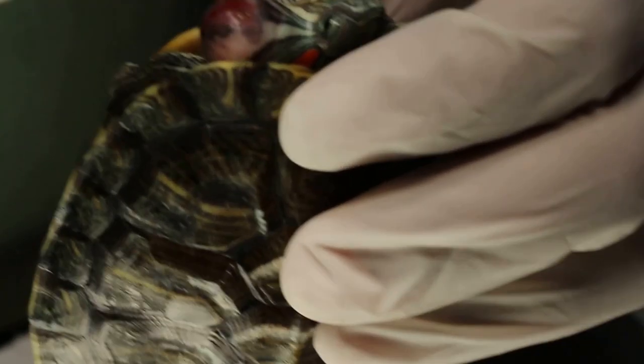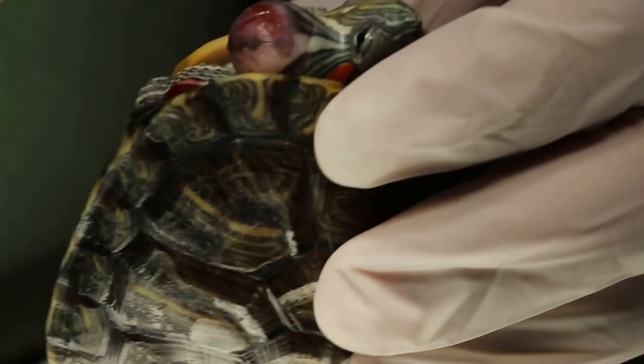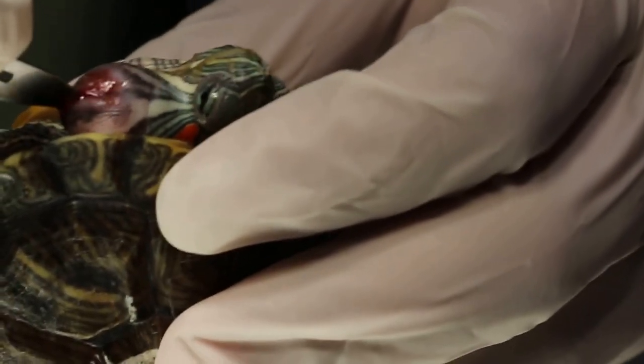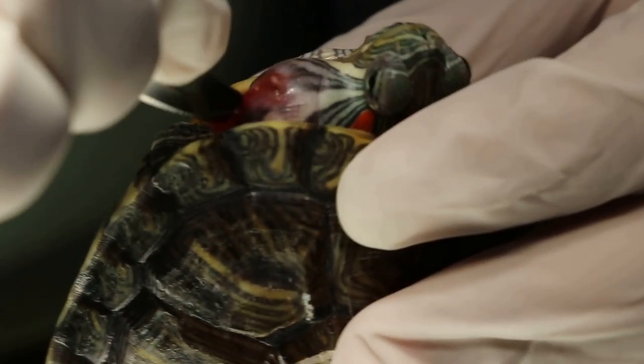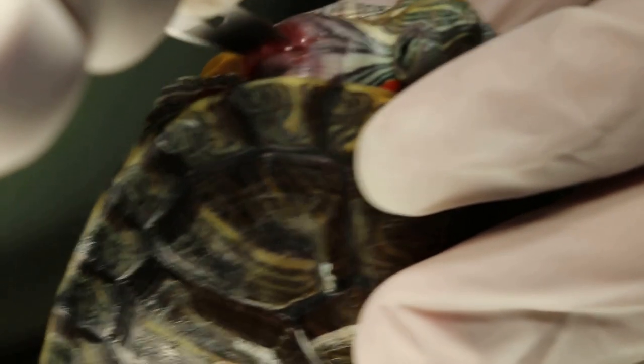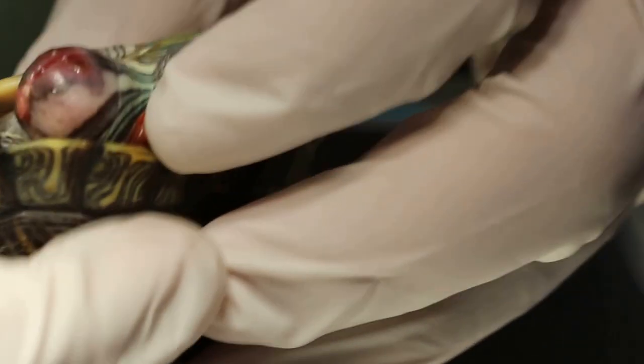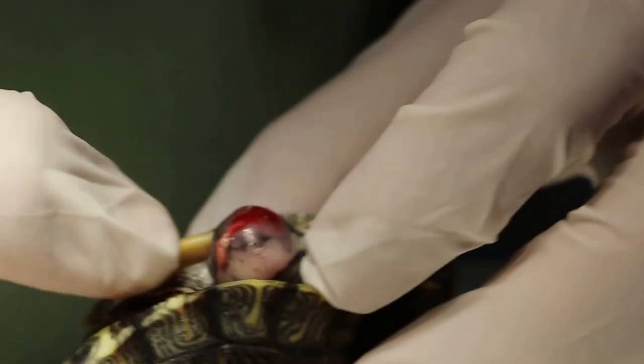So it's not too painful for him. About one centimeter here. The skin is quite thick. Okay, then the curette is here — using the curette to cure out the pus.